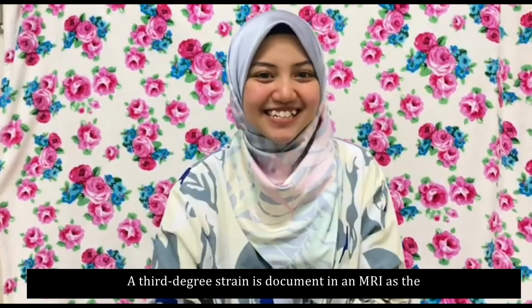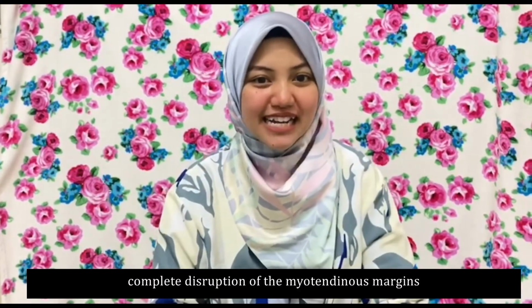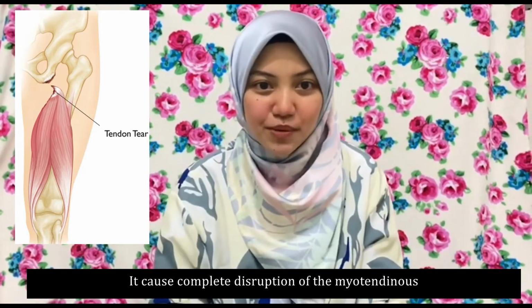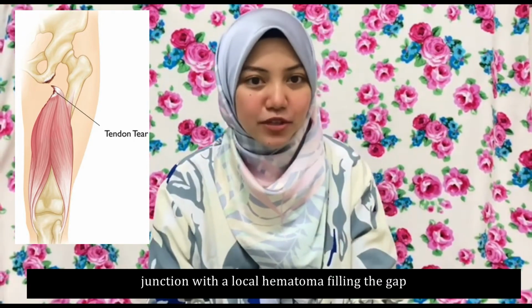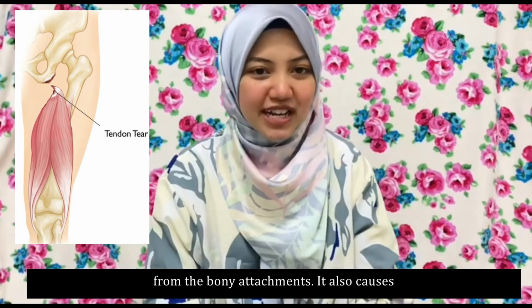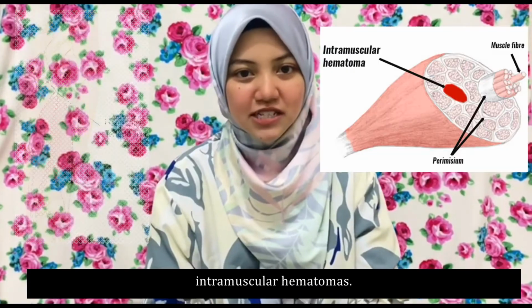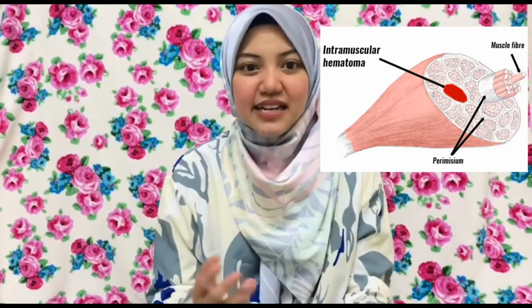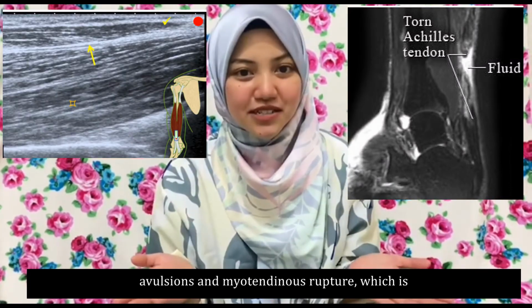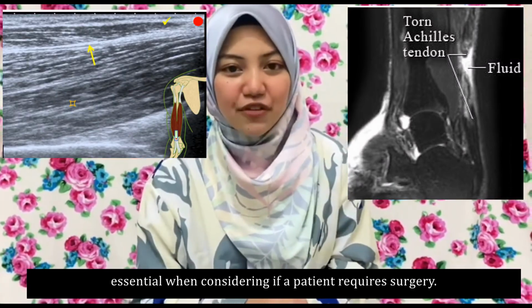A third degree strain is documented in an MRI as the complete disruption of the myotendinous margin and retracted muscle. It causes complete disruption of the myotendinous junction with a local hematoma filling the gap created by the tear, and complete avulsion injuries from the bony attachment. It also causes intramuscular hematomas. In addition, MRI can also differentiate tendon avulsion and myotendinous rupture, which is essential when considering if a patient requires surgery.